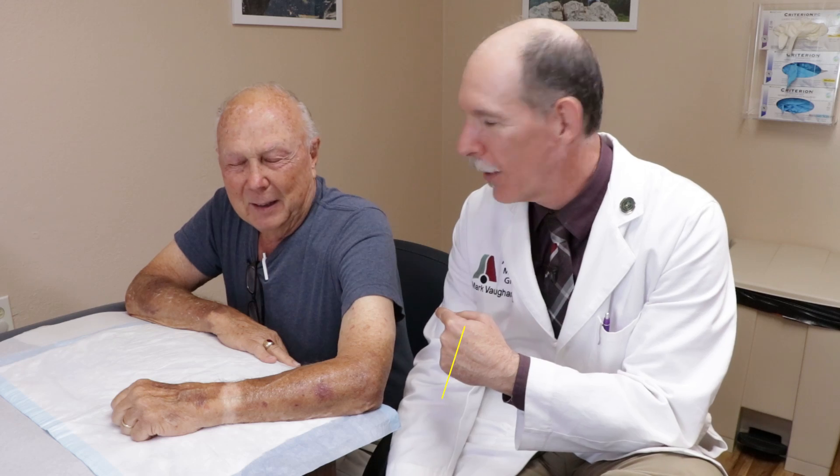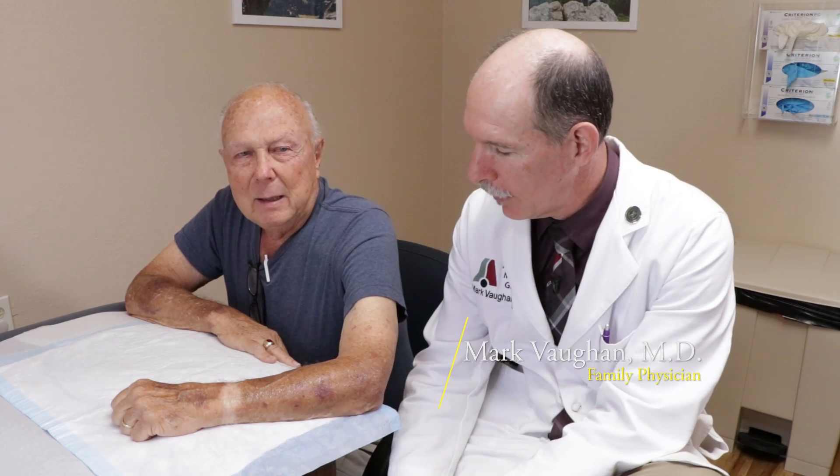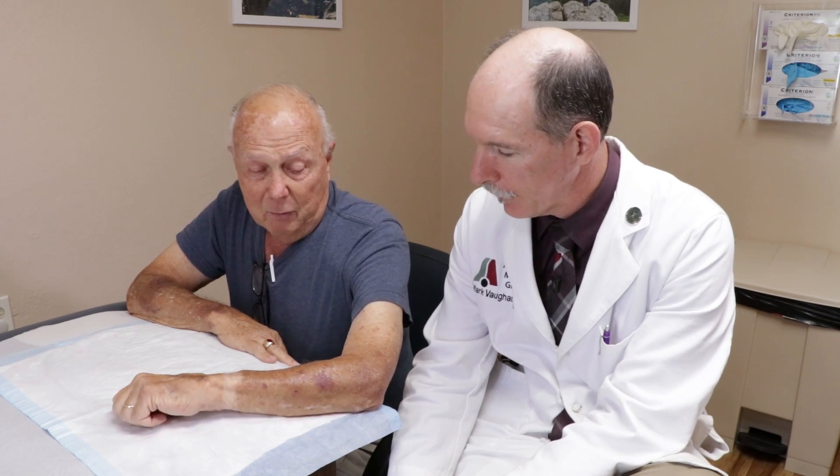Hey, thanks for joining us. We have Earl here, and you have this bump on your forearm that's been there for how long? I don't know. Long enough, huh? Yeah, it's long enough - it wants to go.